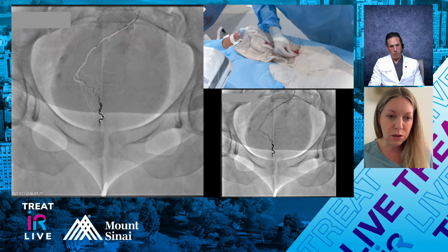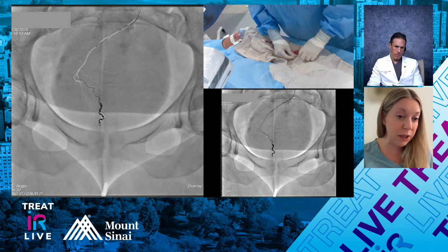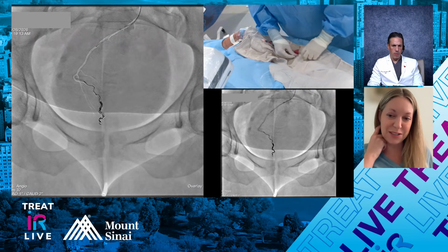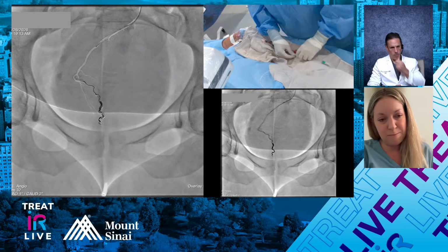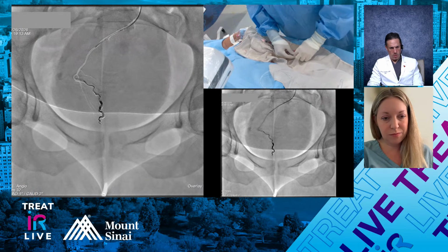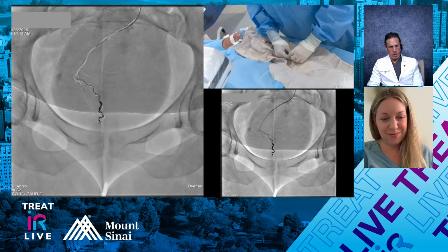So what do you think about that little vessel here? I think you might want to get it if you can. That vessel wasn't apparent on our first run. It's showing itself. Yeah, you have to keep reevaluating things and other branches will pop up. If you just pull out right away, you might kick yourself in the shin.